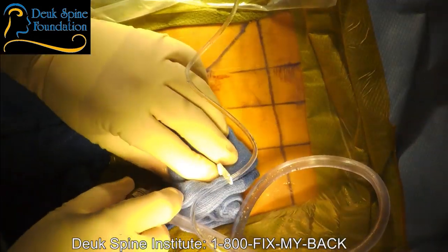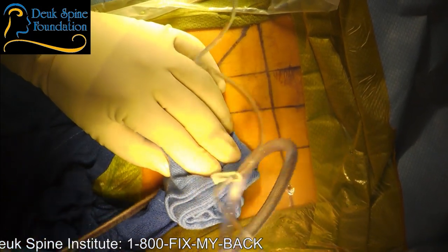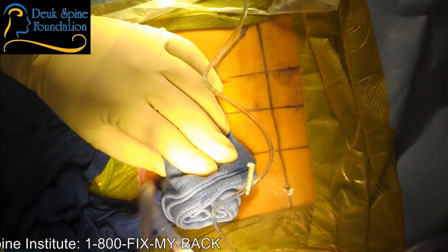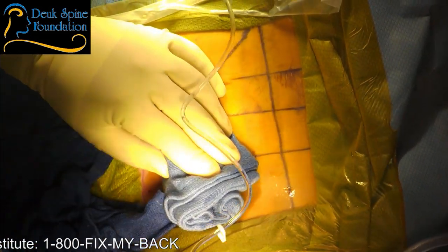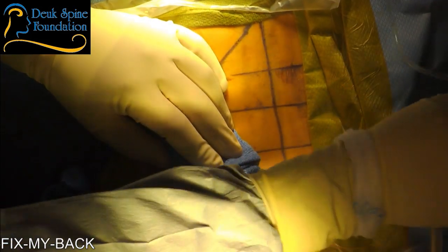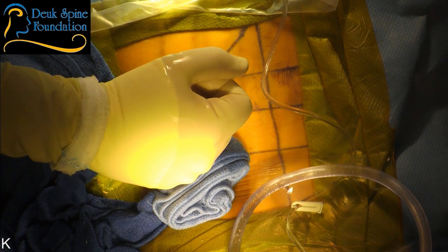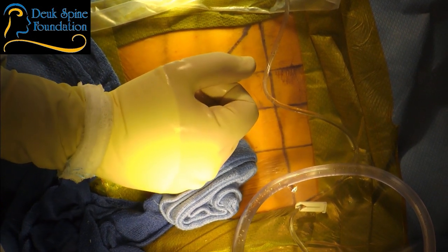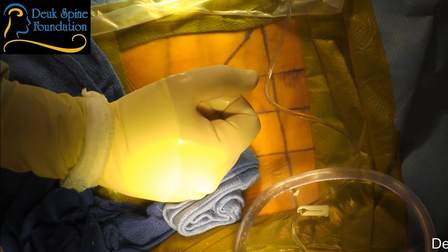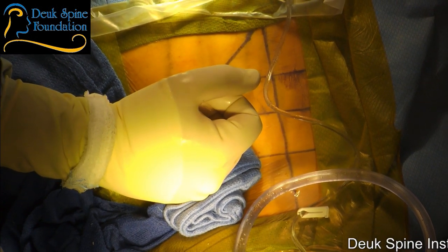We're avoiding removing any bone in this patient because we're going around the bone through a natural opening in the spine called the neuroforamen. That's why this is called a transforaminal approach. It's very special, but unfortunately most surgeons don't know how to do it. They have no clue how to do this surgery. I would say 99% of spine surgeons in the world don't know how to do this type of spine surgery. It's that advanced and that new.